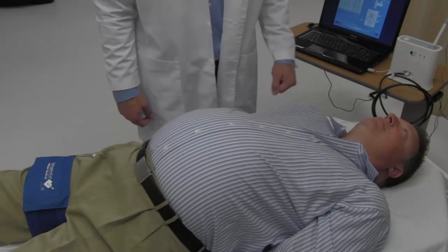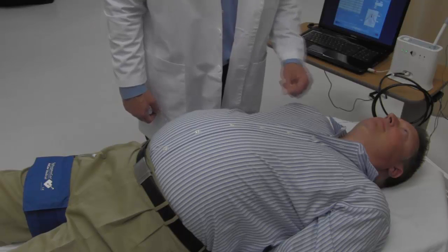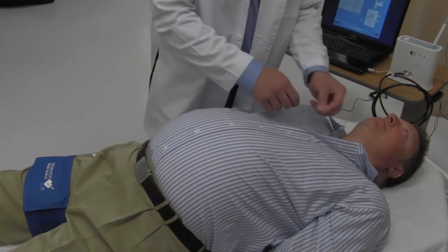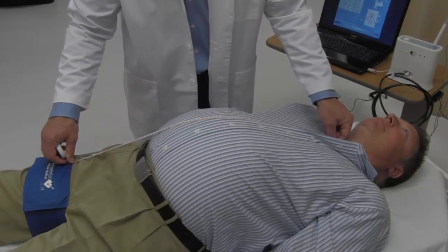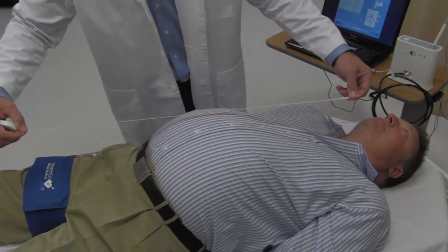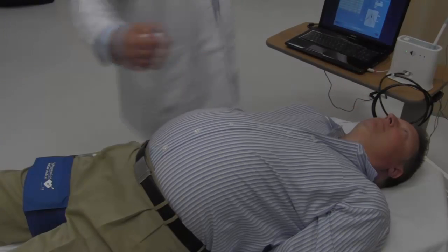It is important to not measure along the contour of the patient's body when measuring this distance. Doing so will result in an inaccurately calculated pulse wave velocity. For a more accurate distance measurement, lift the tape measure off the subject's body, keeping it in a straight line parallel to the surface the patient is laying on, and carefully measure in this manner.